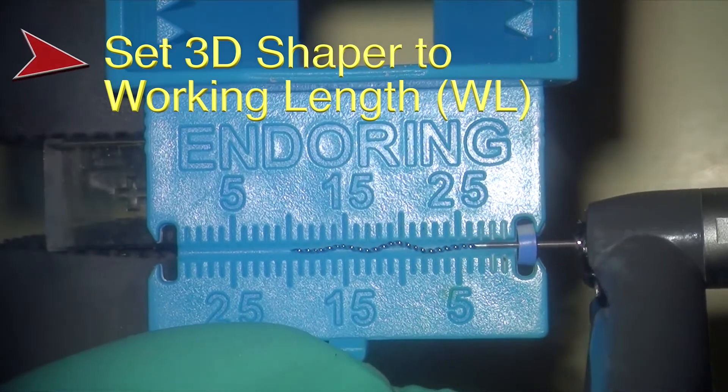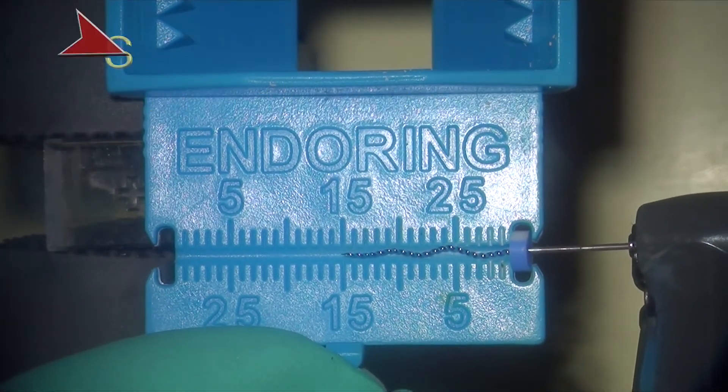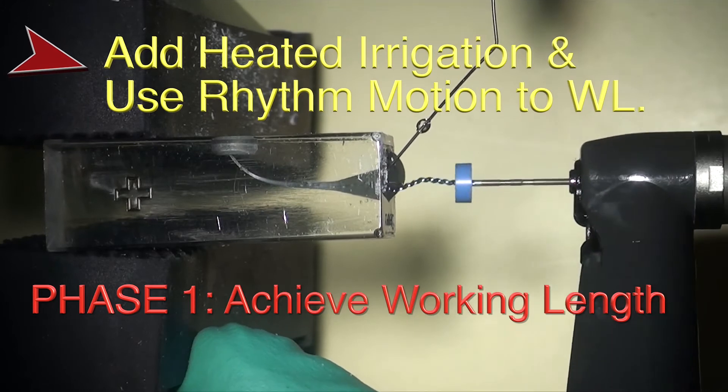You transfer your working length to the Shaper. Here in the block we have to use warm water, but you don't have to use warm water in vivo.